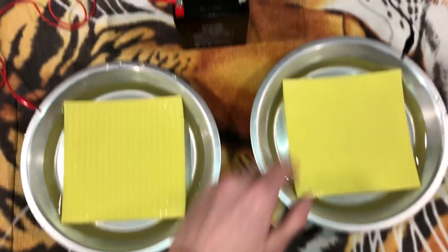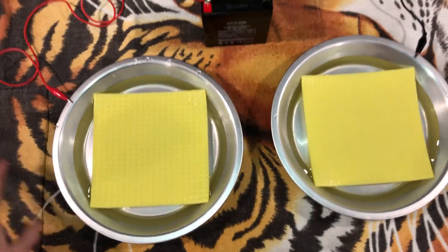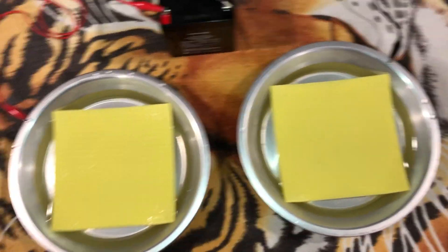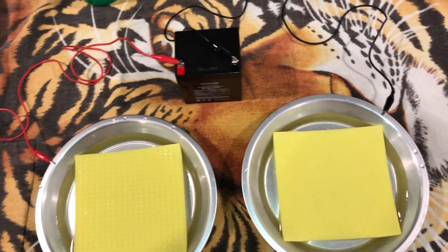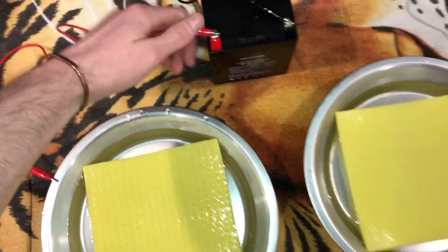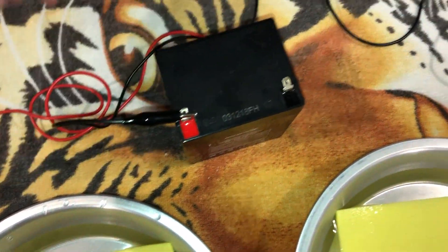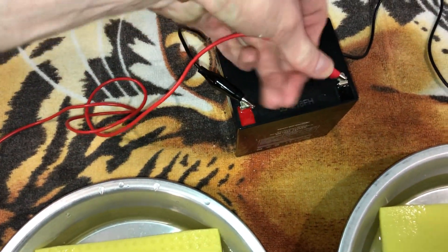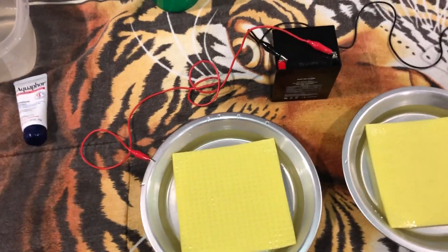Then put your hands in. Make sure nothing is touching and everything is connected. You won't really feel anything, but trust me it is working as long as your battery isn't defective. I started doing 20 minutes every other day — both hands in, and after that 20 minutes switch the clips and do another 20 minutes.